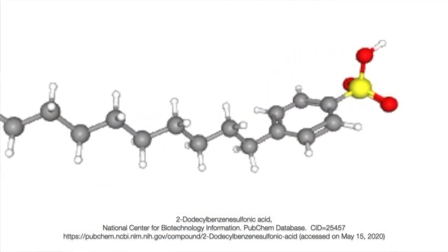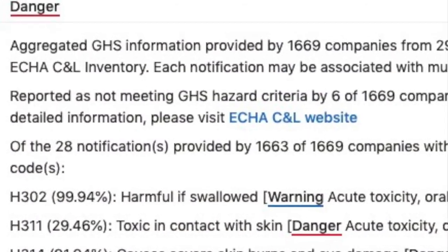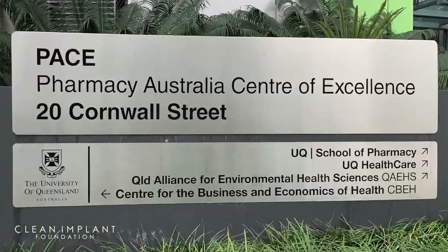DBSA is found in washing detergents, and it is a hazardous surfactant, according to the U.S. Environmental Protection Agency, the EPA. This raises a completely different question besides possible bone loss. Can these impurities also have toxic effects? I don't know. I found a really interesting answer in Brisbane, Australia, but moreover a scientifically based approach as to how we as physicians should basically deal with the problem of the avoidable contamination of medical devices such as a dental implant. So let's go in and ask one of the world renowned experts in toxicology.